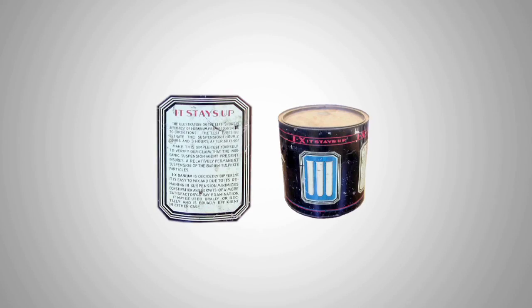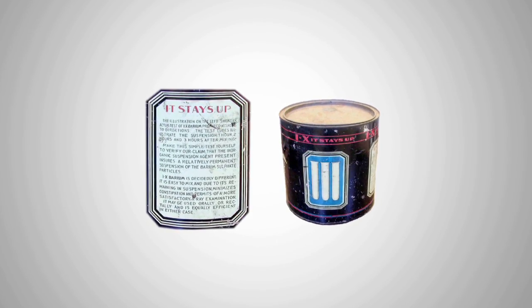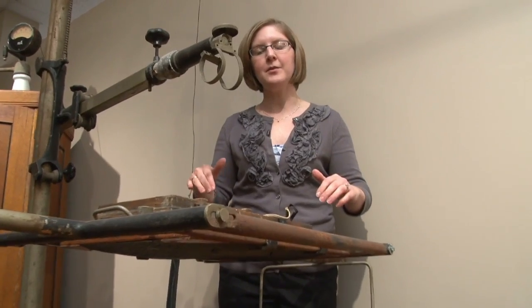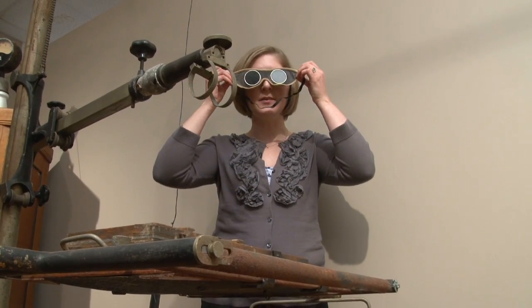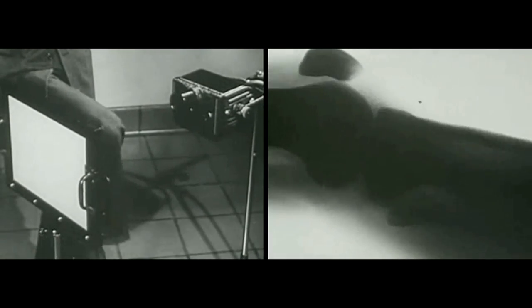For fluoroscopy, the patient would ingest barium or bismuth subcarbonate to make the appropriate soft tissue or organ fluoresce. The table would be placed in a vertical position and the x-ray tube behind the table in a spot corresponding to the part of the body to be viewed. The screen would be placed in front of the table and the room would be darkened. The doctor would wear a pair of goggles tinted red or green, and the x-rays would produce a moving image which the radiologist would observe and then take notes.